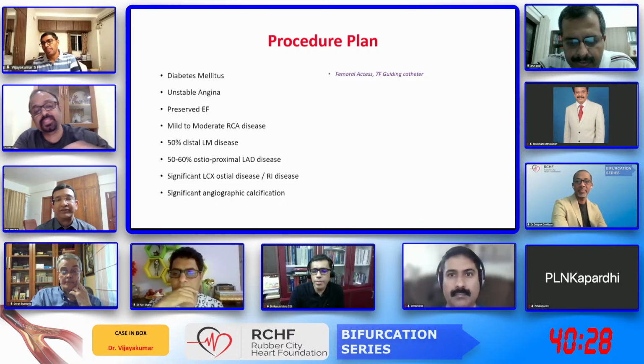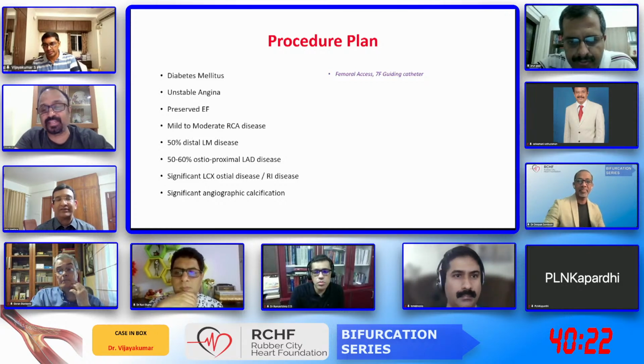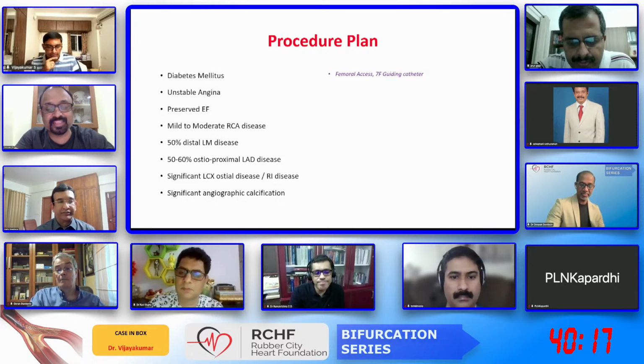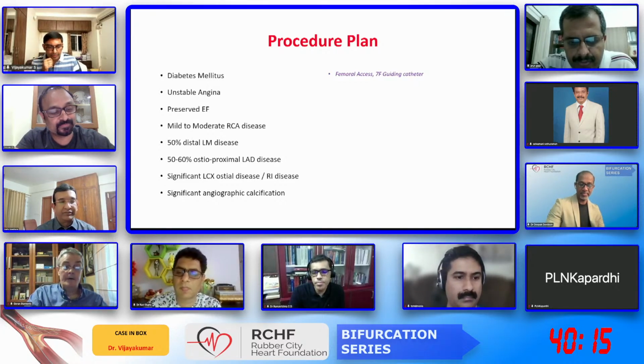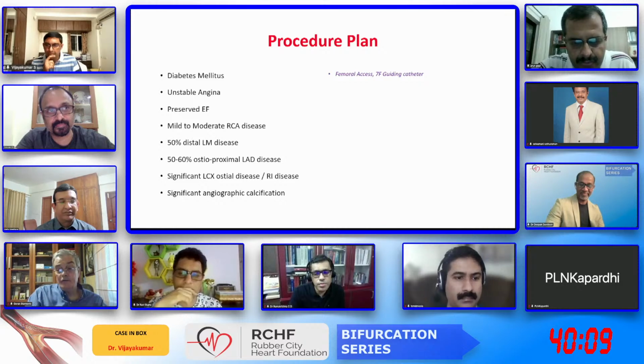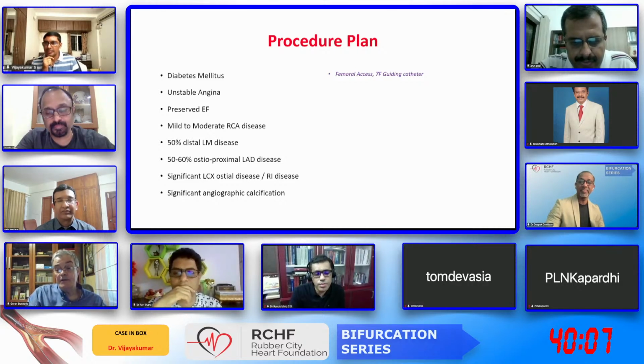But if you ask the question to Dr. Goran, he'll have a different take. That's what he said, a layered provisional, which in his experience in the EBC will actually end up with a single stent. Dr. Goran, your opinion, please, before he proceeds. Yeah, but I'm not saying it's false to have a 2-stent strategy. I just say it's not relevant to decide whether you need 2 stents or not.